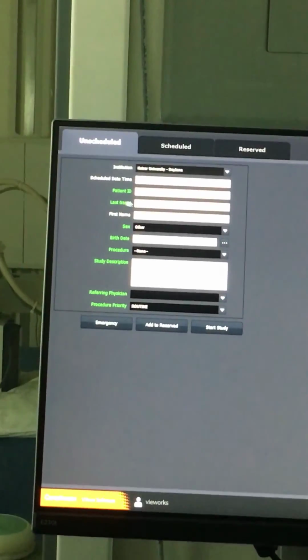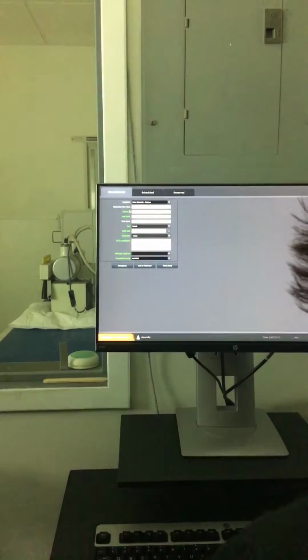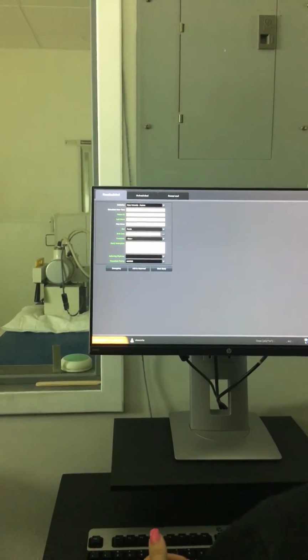If I put in 7126 for me now and enter, it's going to remember me. Does that make sense? So if you've never shot here, it won't autofill. Correct. Mine's 2832. I don't want to make you though. I want you to make yourself.